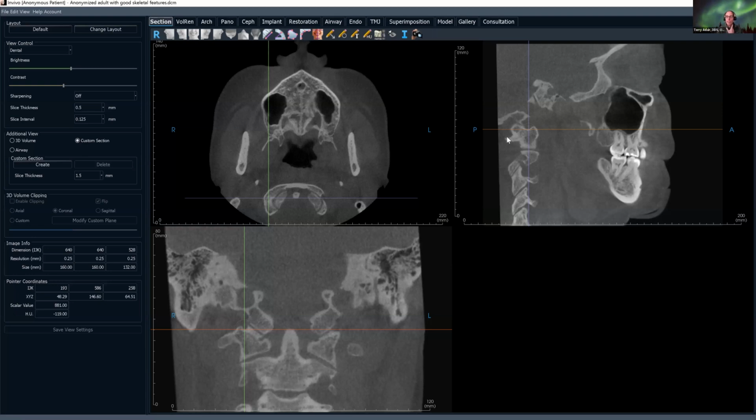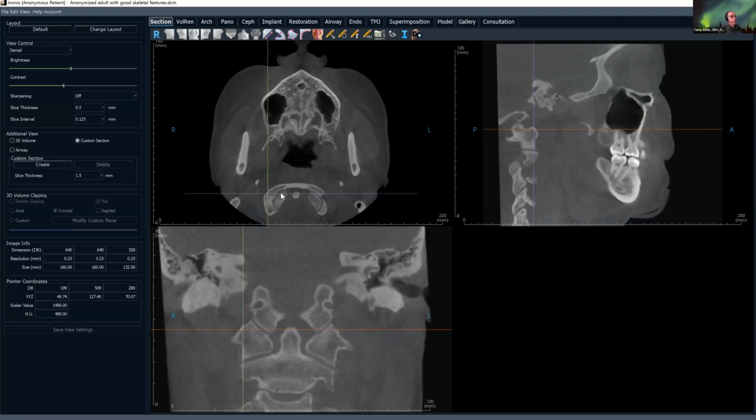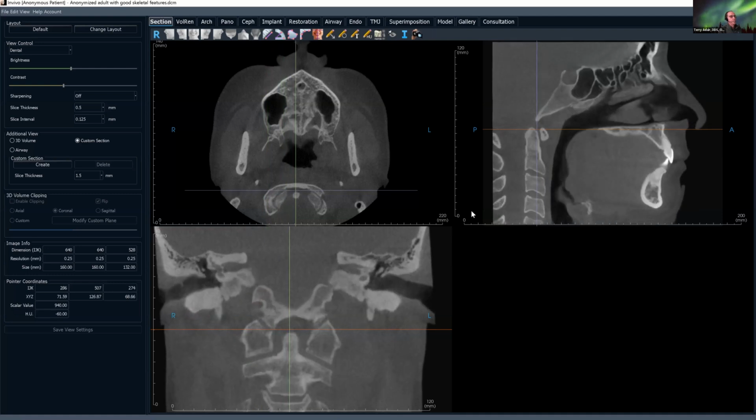In the case of the stylohyoid, you may impinge on the carotid. Here you have important artery and nerves. So I look on both sides. I start on the right side, no posterior ponticle. I scroll through. I pause right here.